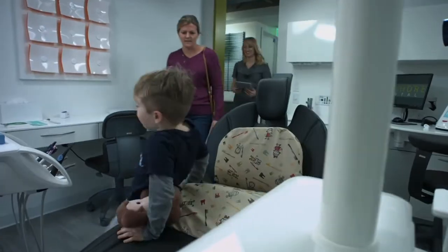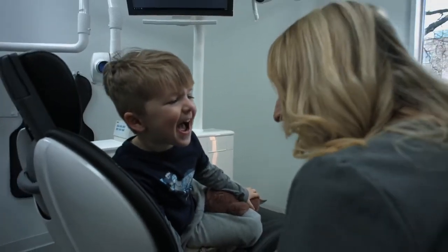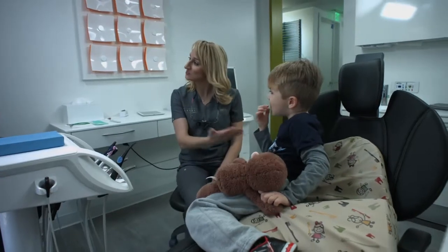At Bayshore Dental, we treat patients of all age ranges, ranging from infants to adults, so it's really important that we have the technology and the imaging tools to be able to treat all ages.